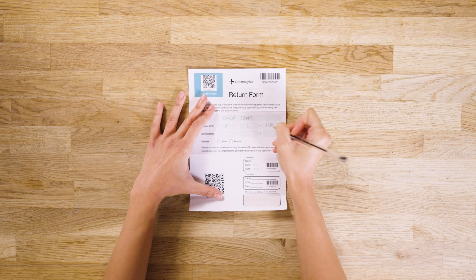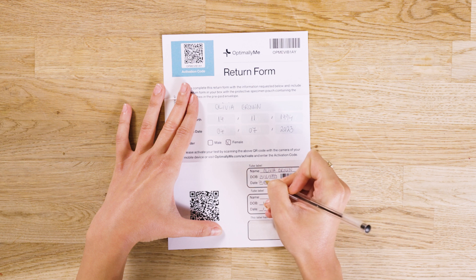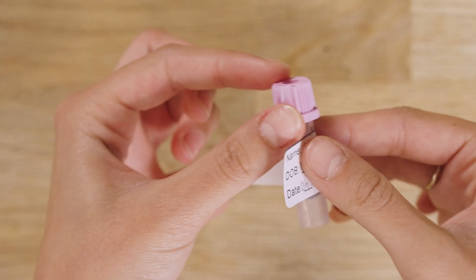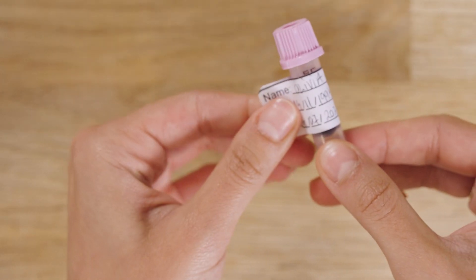Fill out the return form. On the tube labels at the bottom, write your name, date of birth, and the sample collection date. Wrap the labels around the tubes like a flag, making sure your details and QR code are visible.